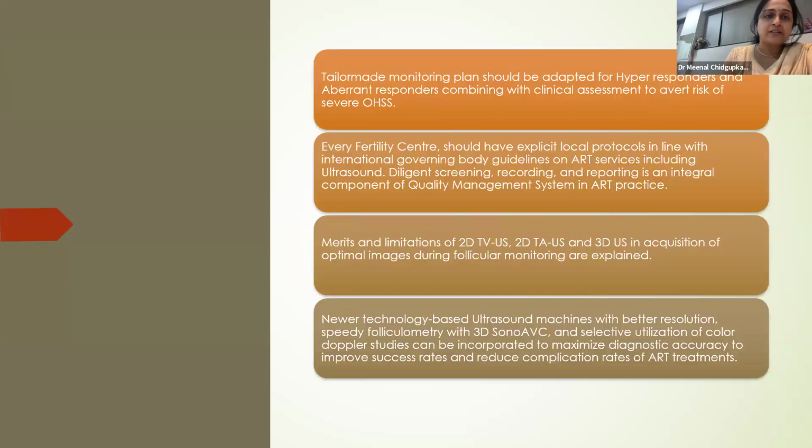Newer technology-based ultrasound machines with better resolution, speedy folliculometry with 3D sono AVC and selective utilization of color Doppler studies can be incorporated to maximize diagnostic accuracy, to improve success rates and reduce complication rates of ART treatments.